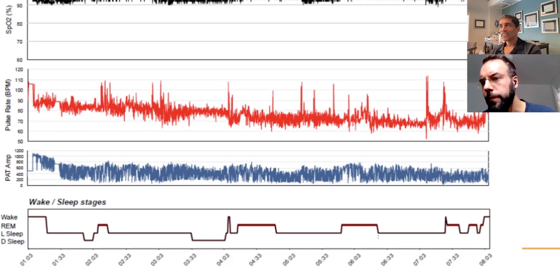Well, okay, that's a big answer to that question. Listen, when you have a small respiratory event, you have a cortical arousal. Well, you can have a sympathetic arousal too, but you have a cortical arousal. By definition, when we score an event, that arousal has to be 3 seconds. Who came up with that number? Whatever, right? So basically, your brain has to go to a wake state for 3 seconds, and that's the cortical arousal. You won't remember any of those, okay?